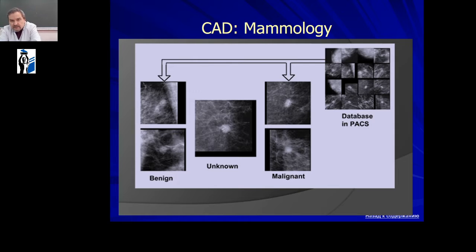In this case, the CAD system differentiates benign and malignant tumors of breast.